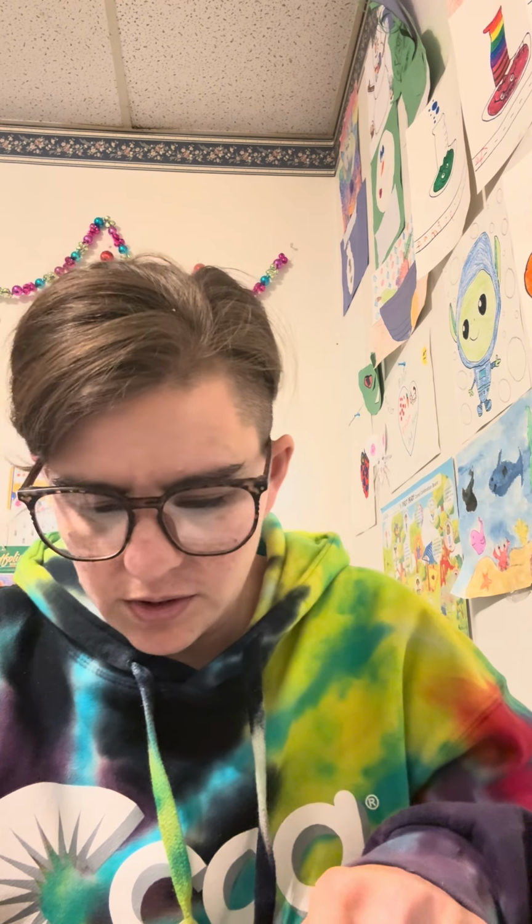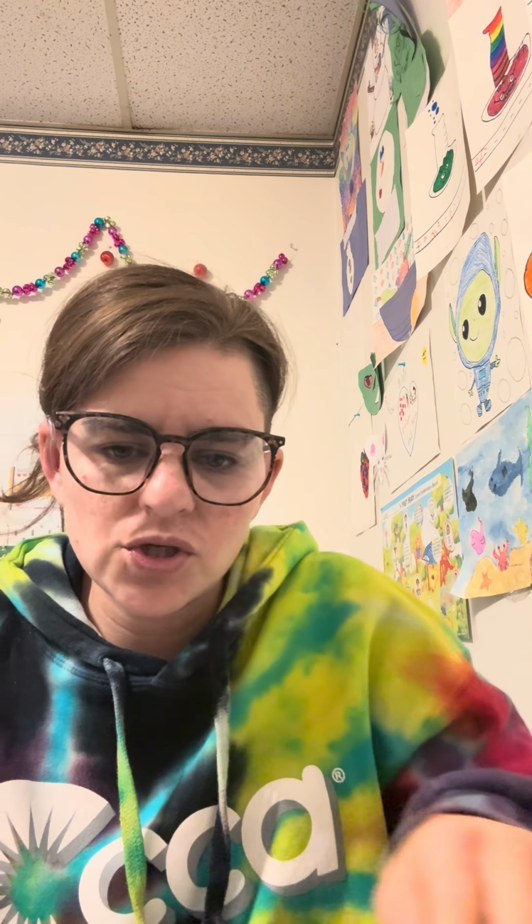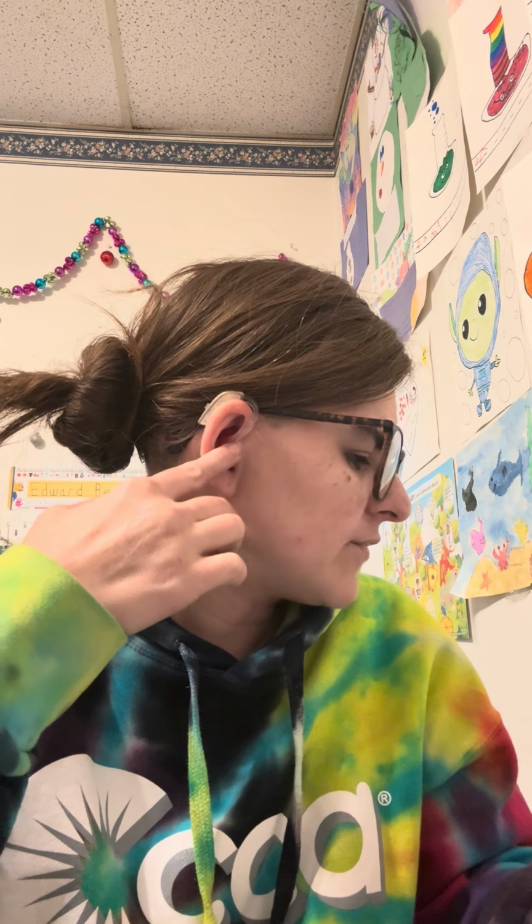The reason is that this one was just tighter than I was normally used to, but this is a new mold, so I'm not sure if it's going to loosen up over time. It feels like the hole is a little bit smaller. But that's fine, because now I have the special tool to do it, and now you have information on how to do it yourself.